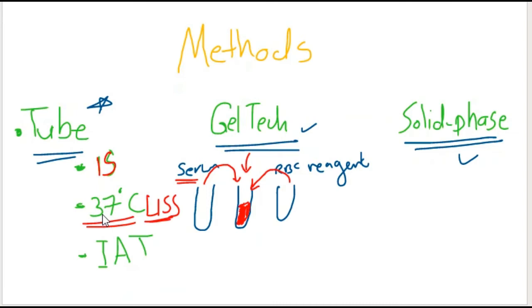So here in this case, it will not be clear if it's from IgM type or from IgG type. There is a very rare type of IgG that can cause agglutination at this level, and sometimes it's from IgM, and it just needs a little bit of incubation time. This is why it becomes positive after incubation for a little bit of time.